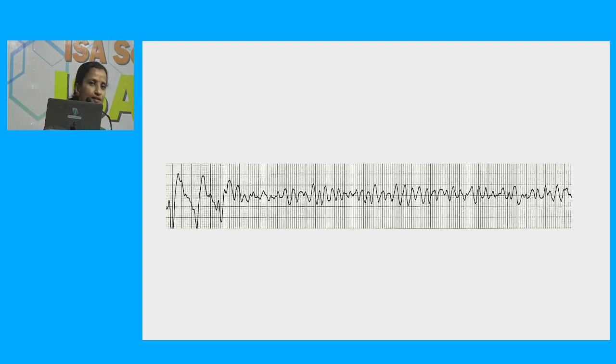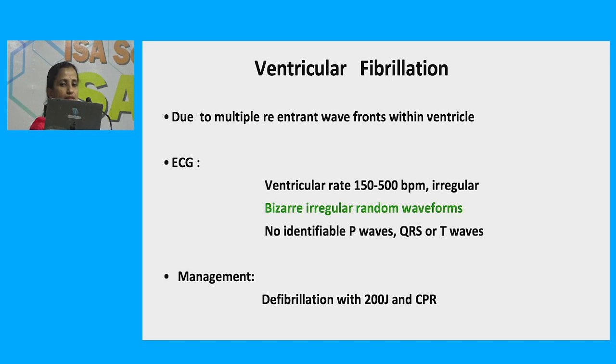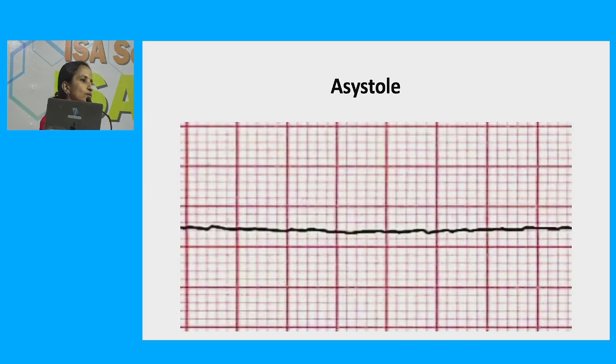Ventricular fibrillation. So how do you manage? Yes, start CPR. I am very sorry, the diagnosis is already there.